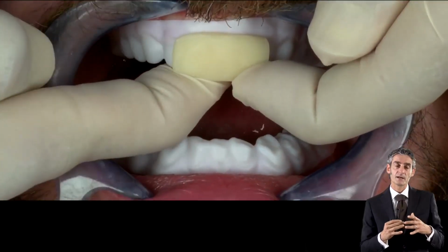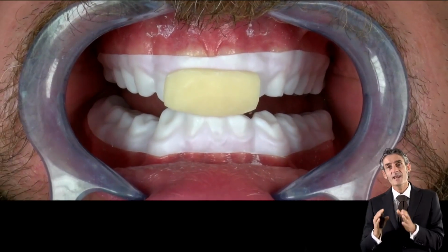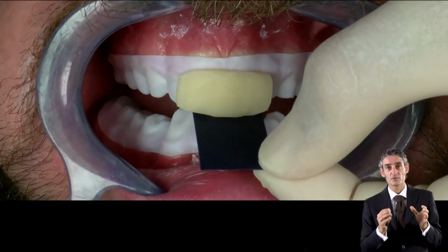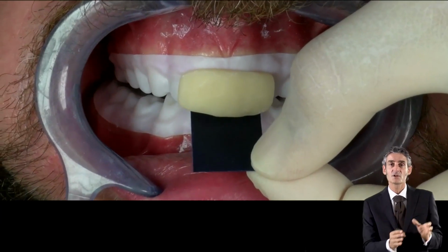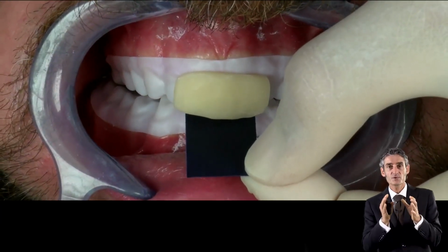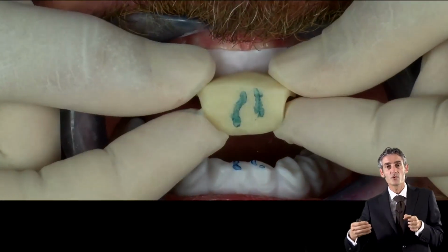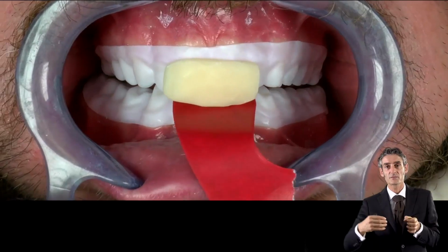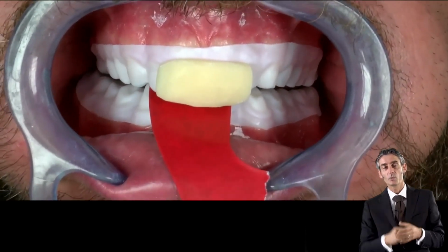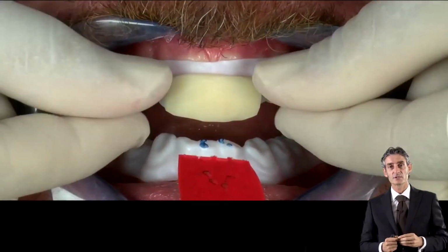And then for sure, another important thing that we have to consider is to never change the vertical dimension inside the articulator if it's possible. So you have to take the bite registration in CR position at the right vertical dimension. And with this procedure, with the use of this plastic foil, in the way to avoid that the hard material of the bite registration can go in the grooves, we can use an anterior deprogrammer already set at the right vertical dimension.